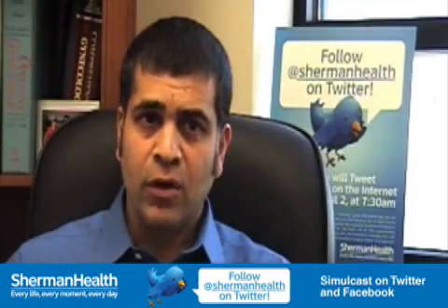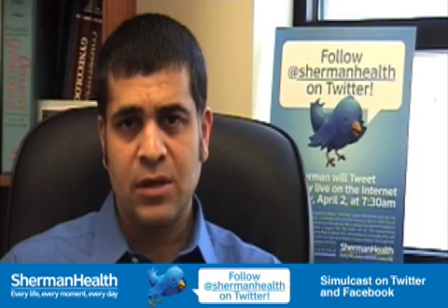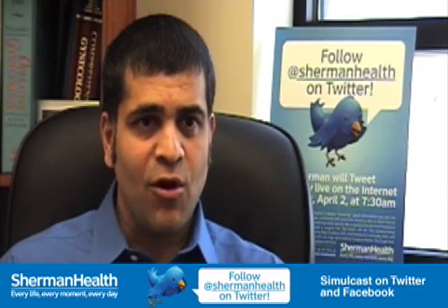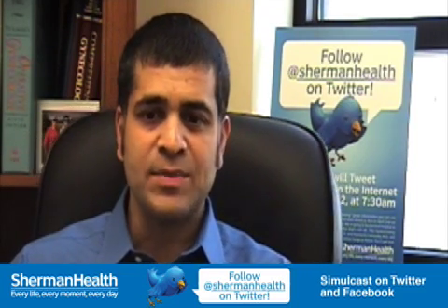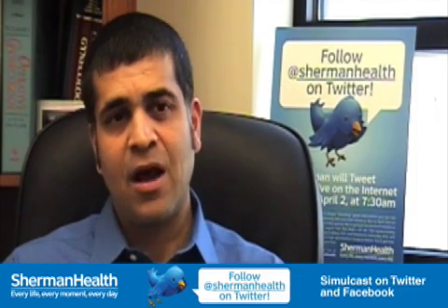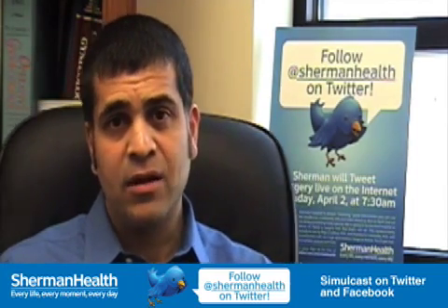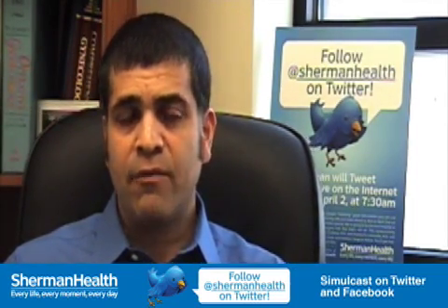A little different at first because as surgeons we're always used to standing next to the patient and having our hands on the patient and working with our own hands, but here it was different. It was kind of virtual, where we're sitting at a counter doing things and we're not next to the patient. So yes, initially it was kind of different, but now I'm very used to it.